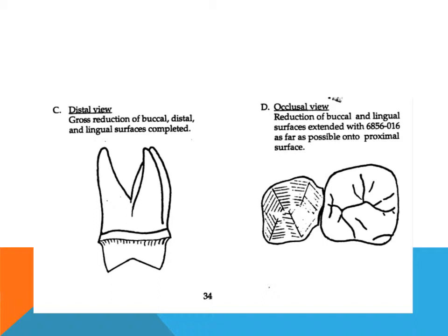When the buccal and lingual surfaces are reduced with the diamond burr, the cuts are extended as far as possible onto the mesial and distal surfaces, without touching the contact area of the adjacent tooth.